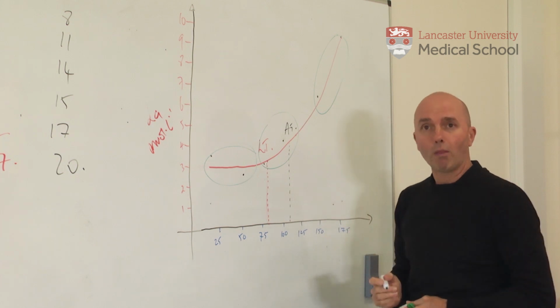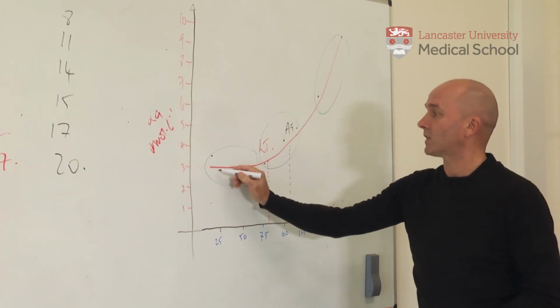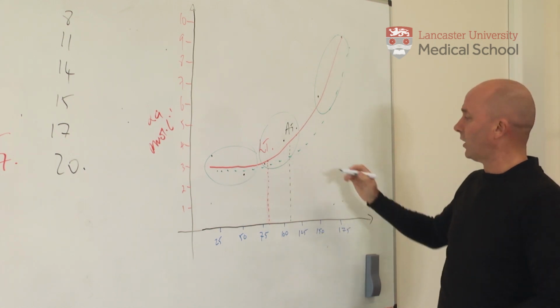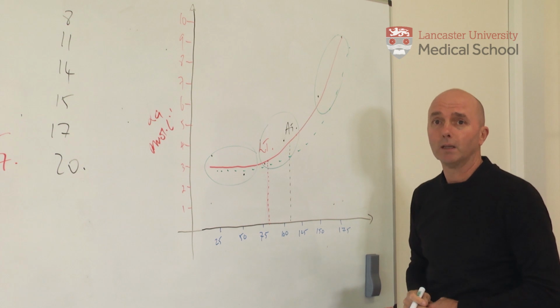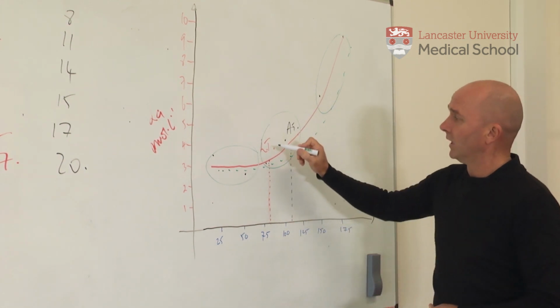We can also plot this again next time we test Chris to see if we can shift this curve to the right, so that he can work at a higher intensity and produce less lactate, and we can show that he's improved efficiency.